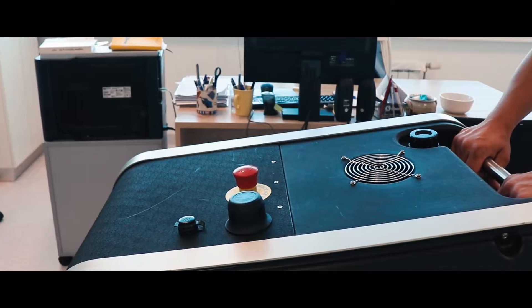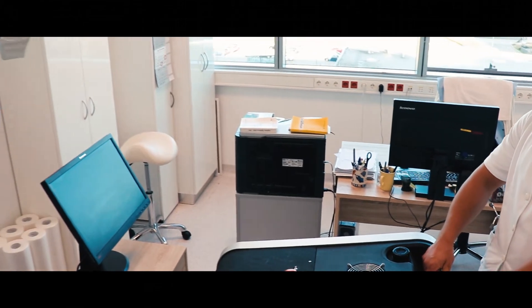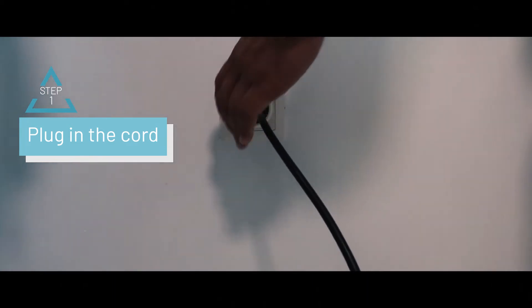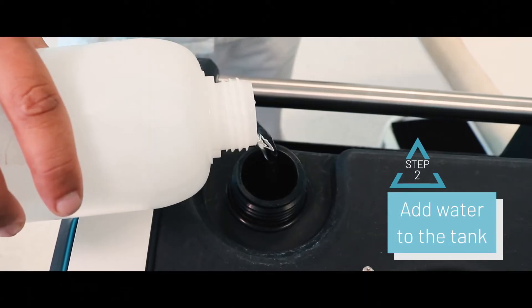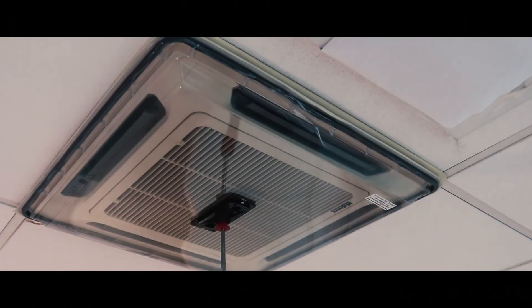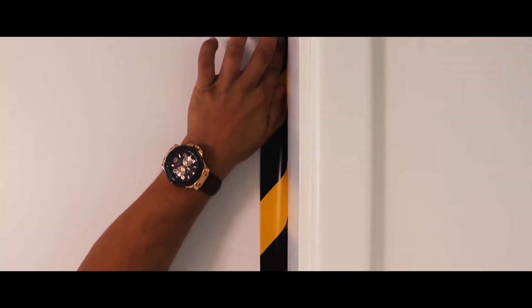Once the robot is placed inside the room for disinfection, all you need is to follow a few simple steps. Step 1: Plug the cord in the nearest outlet to start the unit. Step 2: Make sure to add water to the tank before starting the process. Step 3: Ensure that the room is completely sealed off with the use of our customized sealing equipment.